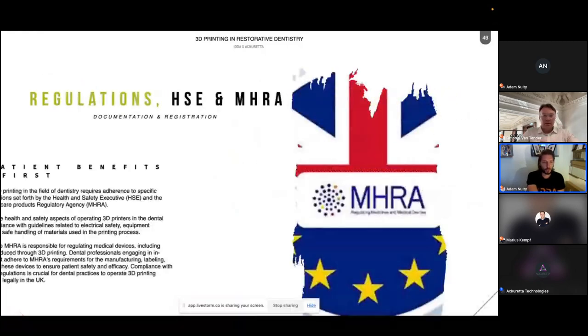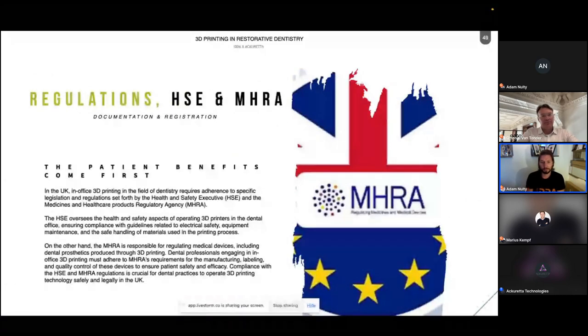Something which will apply, obviously, to the UK and the US probably more than anywhere else. Yeah, definitely. With all of the steps that you take with all of these things, it's really important that you follow the manufacturer's recommendations and that you have a validated workflow if it's an intraoral device. In the last year or year and a half, we've been really focusing a lot in our teaching to make sure that we teach the validated workflows and the importance of that, because you don't want to be one of the outliers that cause a problem for your patients and then be in trouble for that. You want to, like Adam was saying in the previous slide, do what is best for your patients and make sure that you are doing everything according to regulations, whichever country you're in. You have to follow those regulations.